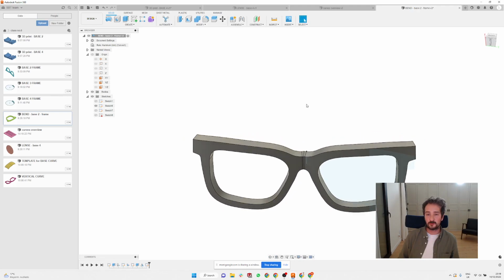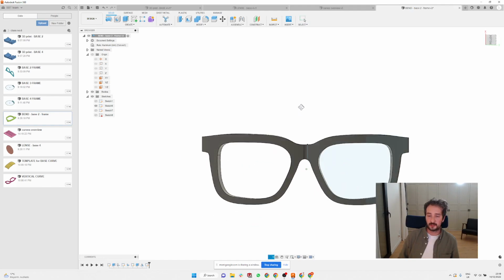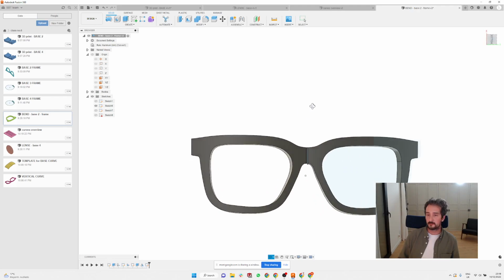So if you play with a base 4 curve, you can see there's a massive difference between a flat frame and a bent frame. The frame is suddenly much smaller, it looks a bit different, and all the shapes look slightly different. So it's quite good to try it before you start bending the frame. This is kind of an easy way to do it, and it's not very problematic.